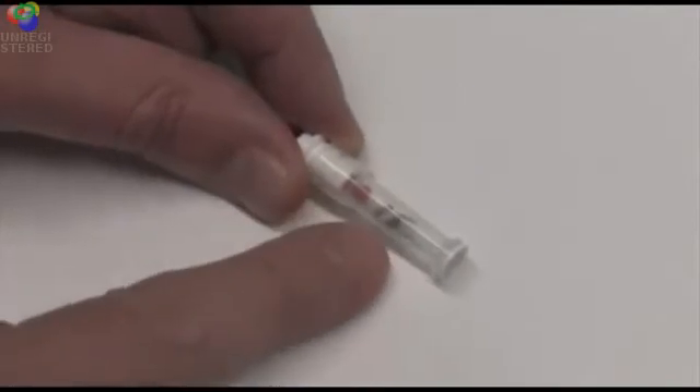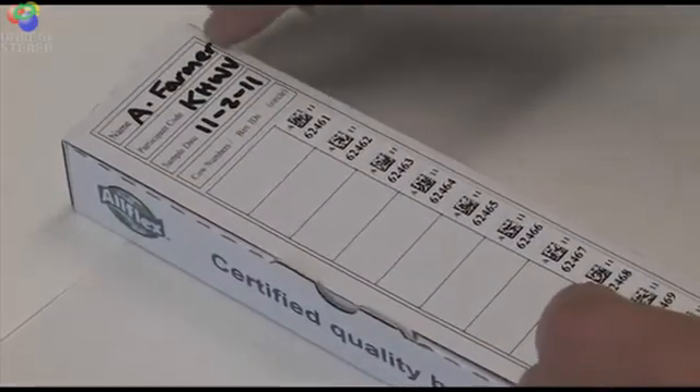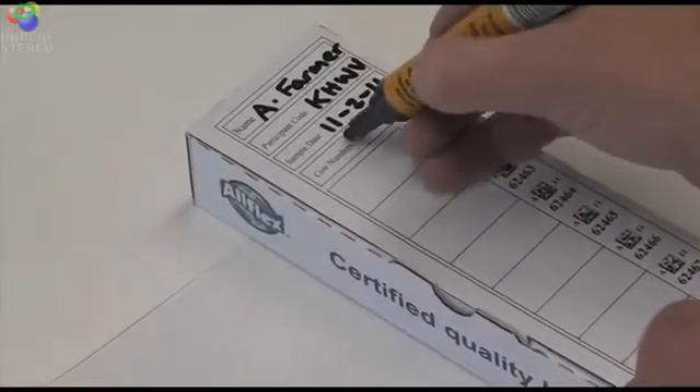The red plunger pushes the sample into the tube as well as capping the end of the tube. The top of the box forms a submission card. Fill in your name, participant code, sample date, and then circle either cow numbers or birth IDs depending on what you're using to record your animals.